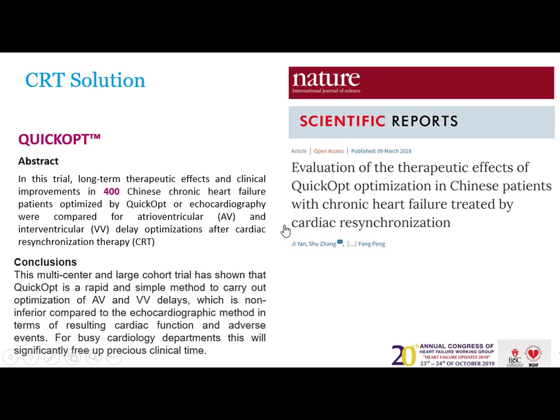This is the CRT QuickOpt solution from St. Jude, and they evaluated the effect of QuickOpt. QuickOpt is automatic; the machine does it. The Chinese took advantage of having fewer regulations in their country to make this study, trying this QuickOpt solution in 400 heart failure patients, comparing it to the regular echo, and they found very good results.